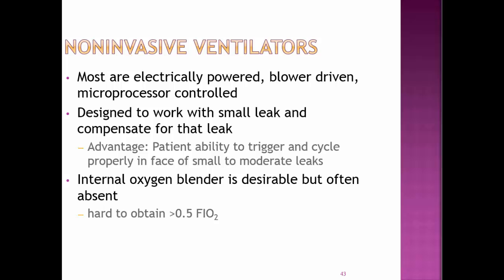The advantage is the patient's ability to trigger and cycle properly in the face of a small to moderate leak. An internal oxygen blender is desirable but often absent, and even then it's hard to obtain anything greater than 50% FiO2.